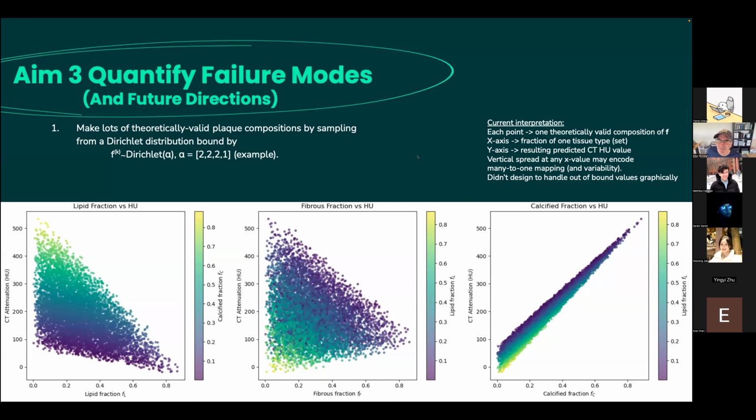So moving through this pretty quickly, we weren't able to build the full spatial model with the mapping onto the CT or anything like that, but I was able to extract these interesting little graphs that showcase more on the Raman side of things versus the CT side of things, whether or not the lipid fractions and the CT attenuation could potentially be related, so the actual lipid fractions, as well as the calcified fractions. This is kind of normal information. There's nothing too exciting here. Because you'd expect that as your lipid fraction increases, maybe your CT attenuation might decrease, right? And depending on the way that you scaled it.